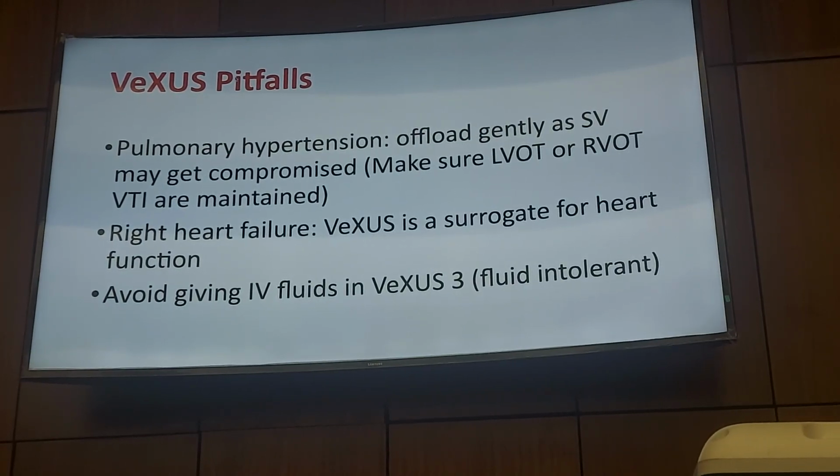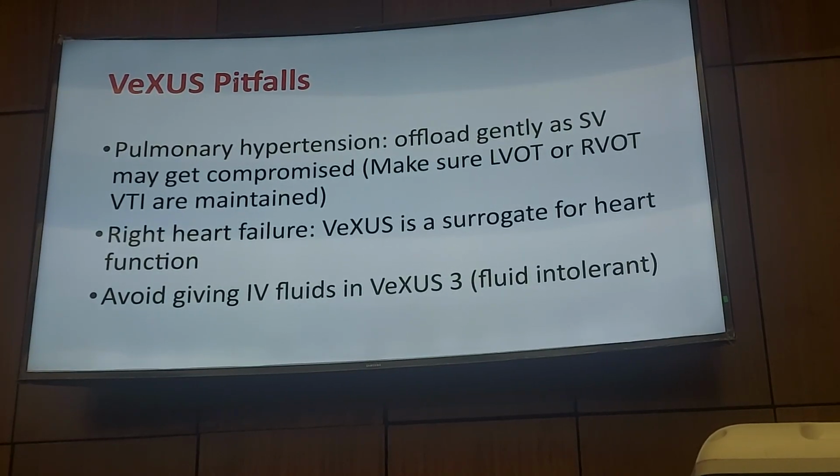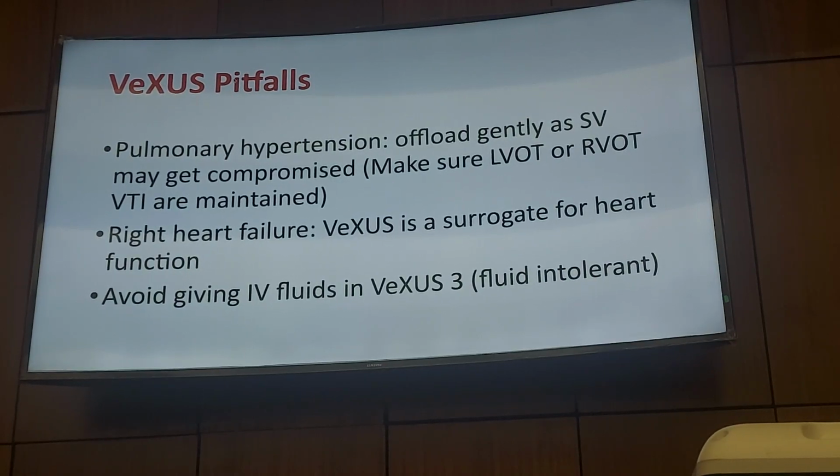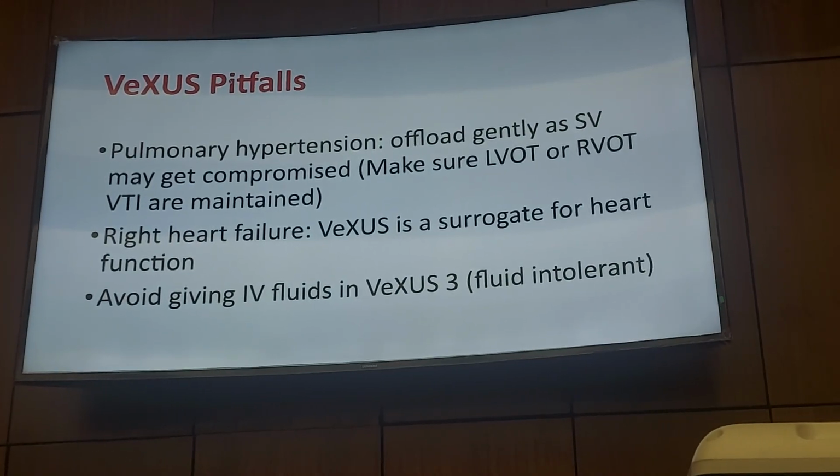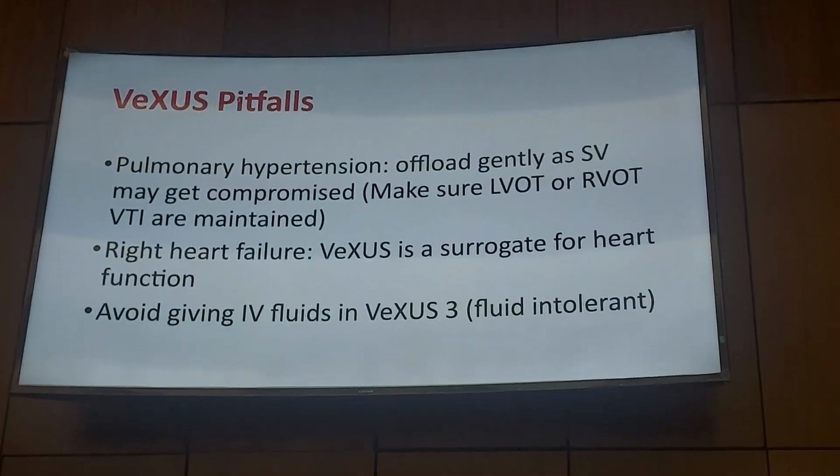Another point of the whole protocol: if I see a patient with VExUS score 3, I tell my fellows, we don't give them any fluids unless they have invasive cardiac output monitoring. Because remember the Guyton venous return curve? Now you know that you are in the danger zone.